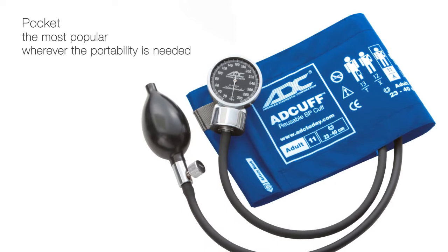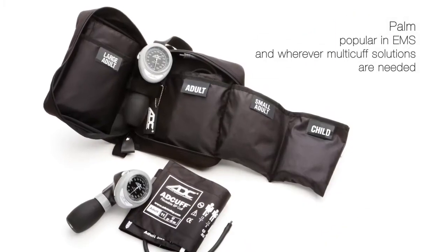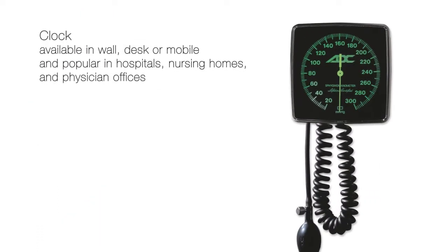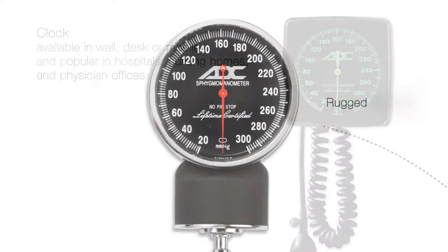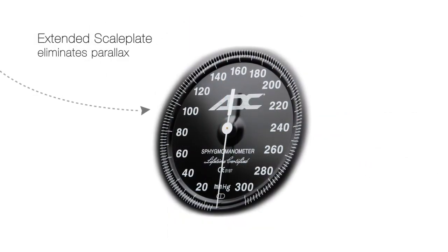ADC manometers are produced in three basic platforms. Regardless of the design, ADC manometers boast a variety of world-class features.